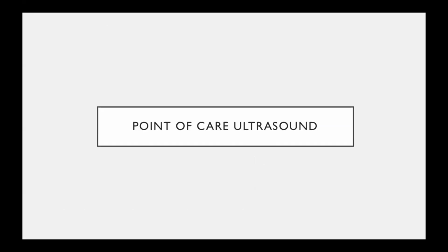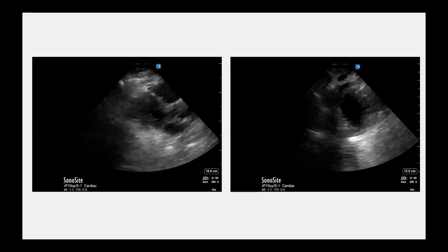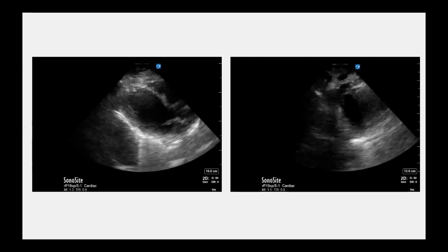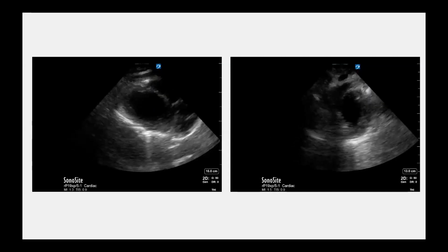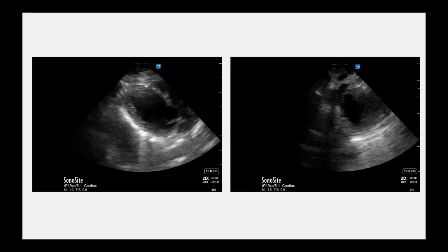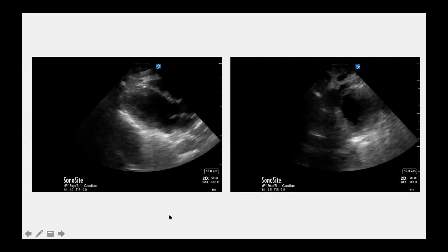While she was in Cat 1, she was tachycardic, tachypneic, and hypoxic. So we did a point of care ultrasound to better assess her volume status as well as looking at her lungs. Here are our first images that we have. I'll open it up to discussion as well as our fellows. The two major questions: what sort of imaging windows are we looking at, and what sort of findings, if any? We could start with the image on the left.